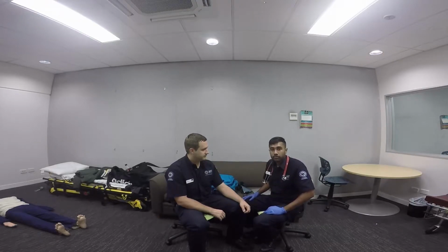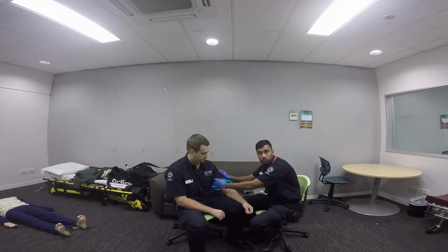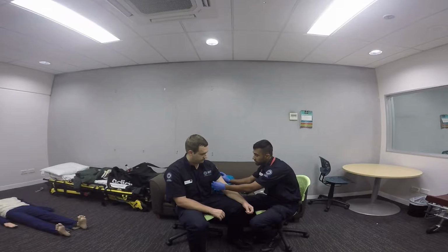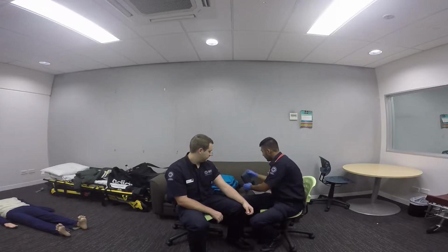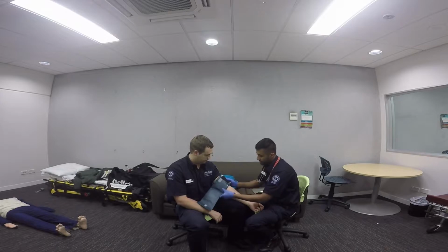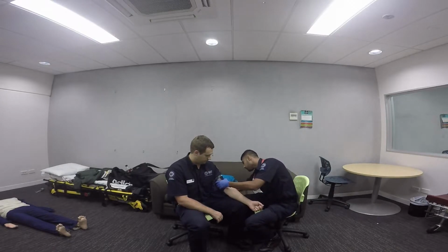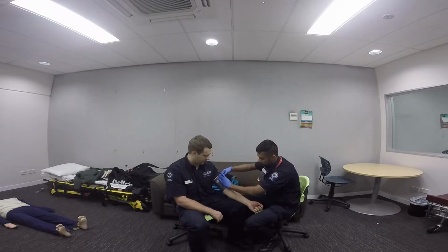Okay, to start that process off, we're going to remove any restrictive part of the patient's clothing. So I'm just going to wrap up his t-shirt like so, so we've got a good area to put the blood pressure cuff. Then the next thing I'm going to do is place the blood pressure cuff like so, wrapping it around Martin's arm. How does that feel, Martin? That's all good? No, it's all good.